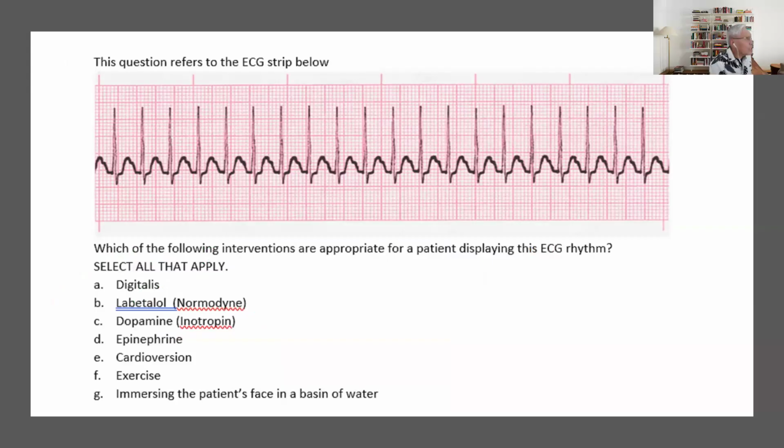All right, I have a question here, but I don't want you to answer the question as it is. What I wanted to illustrate over here is this is a tachycardia. So what did we say the heart rate was earlier? What is the heart rate? Tell me the heart rate. 200? 200, yes. Okay.